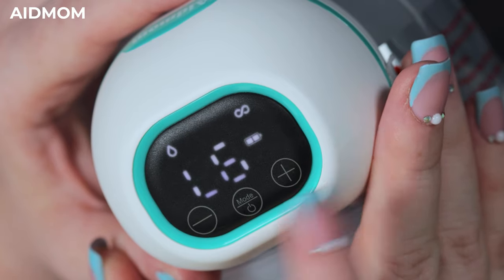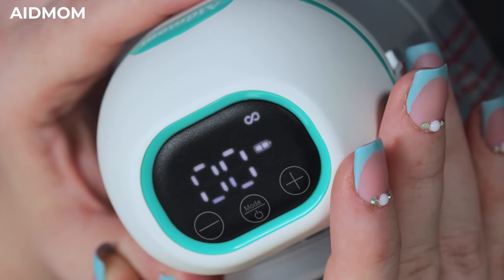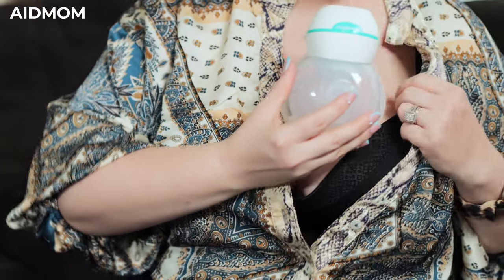There are 9 levels of power suction. A self-timer will turn the pump off after 30 minutes of use. Our battery capacity will last for about 80 minutes total between charges — that is 3 to 5 times of use.